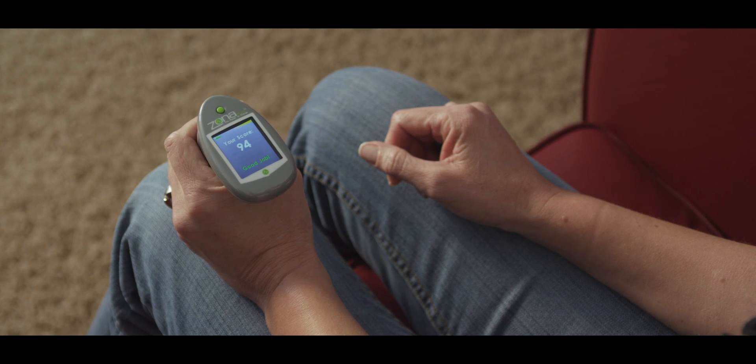You won't break a sweat, but believe me, it does take effort. At the end of the session, you'll receive a score between 0 and 100. Anything above 80 is considered good and a successful therapy.